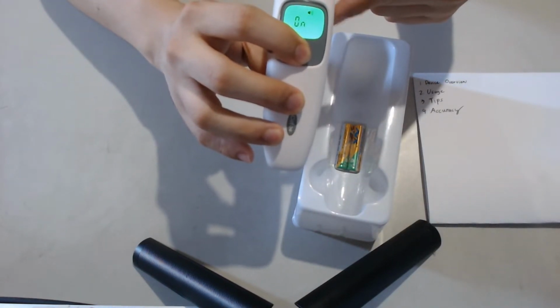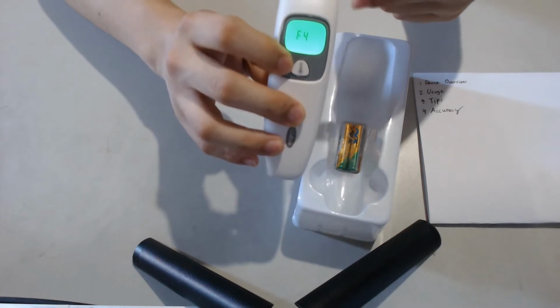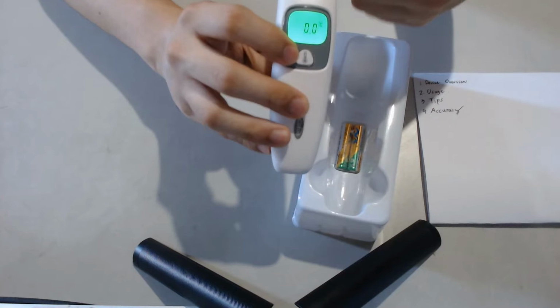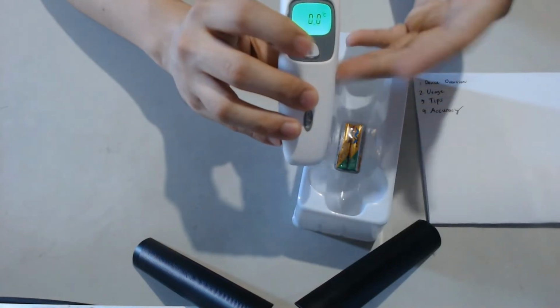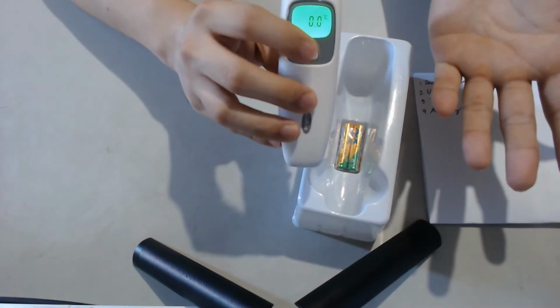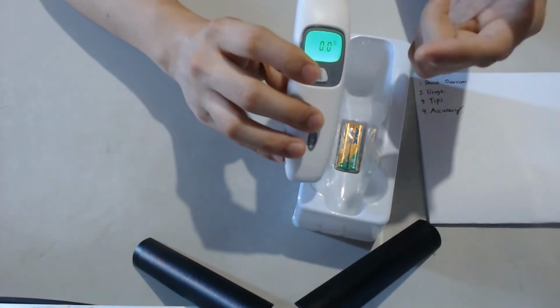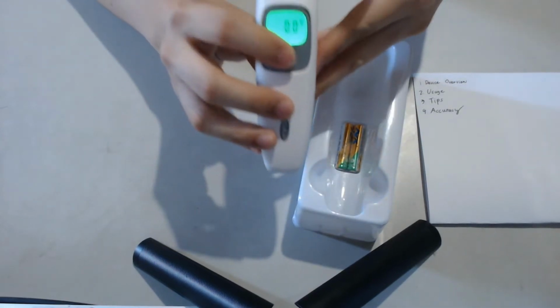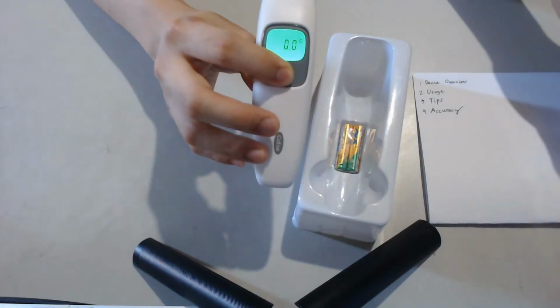The next one is an adjustment. Once it takes the temperature, it will add or subtract by this value. I don't want to change it, but you can press this single button to have an offset, which I don't want to touch right now. And finally, that's it.